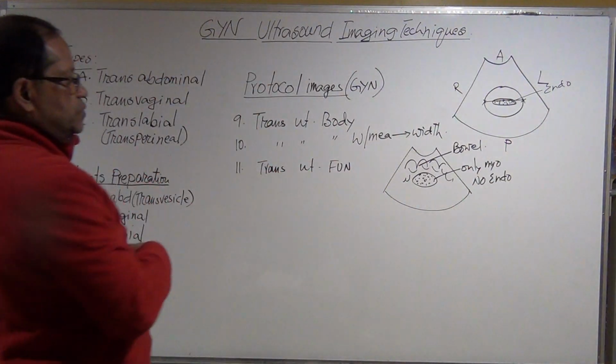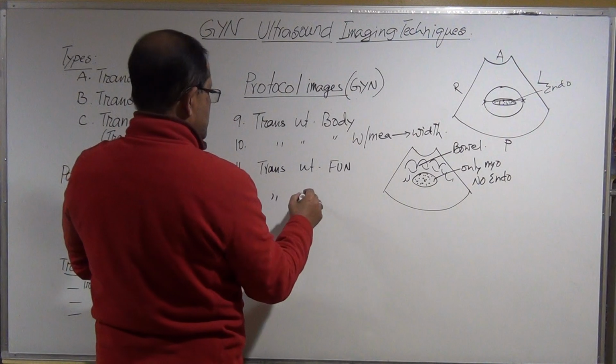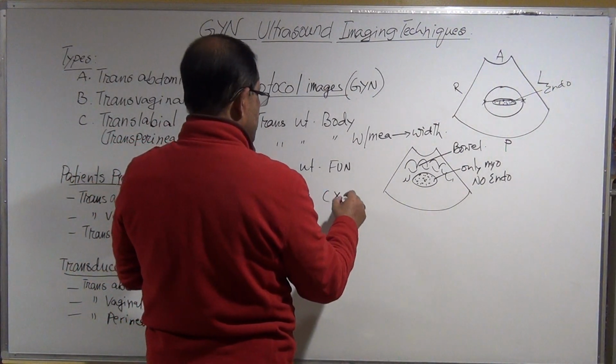Lot of bowel. Now 12, transverse uterus cervix.